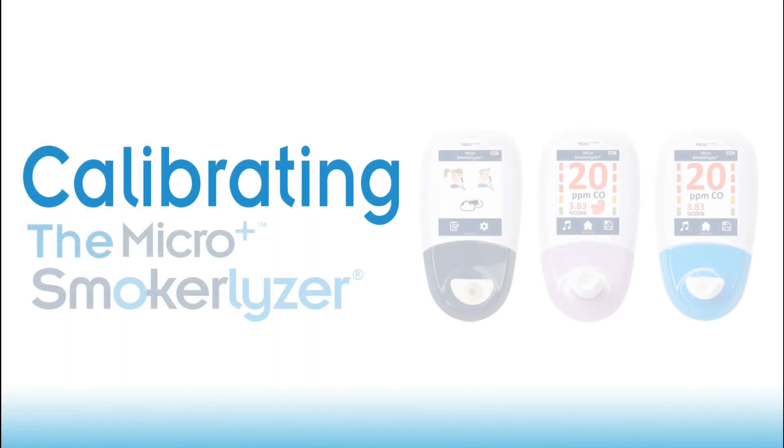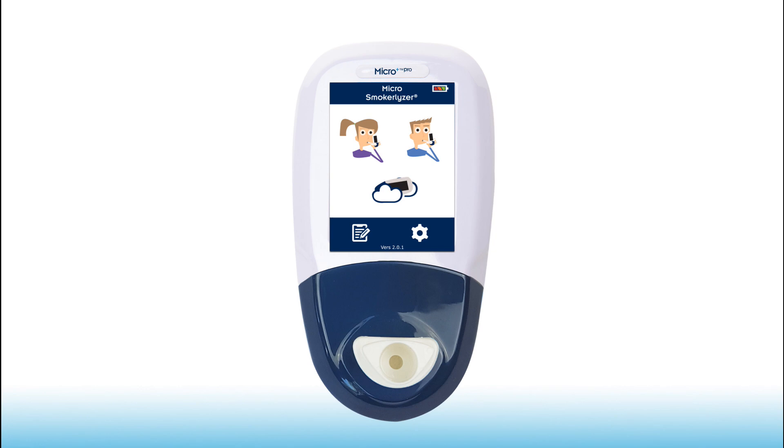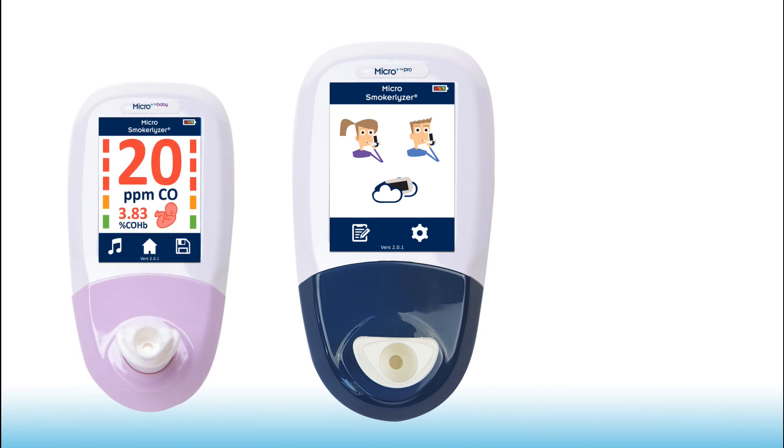Hello! In this video, we will be calibrating the Covita MicroPlus Smokerlyzer. Here we have the MicroPlus Pro model of the Smokerlyzer family. However, you can follow these same steps to calibrate the MicroPlus Baby and MicroPlus Basic monitors.